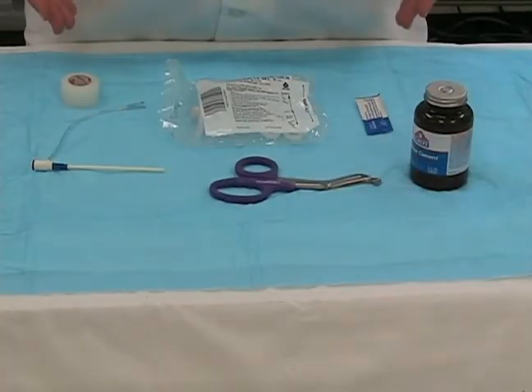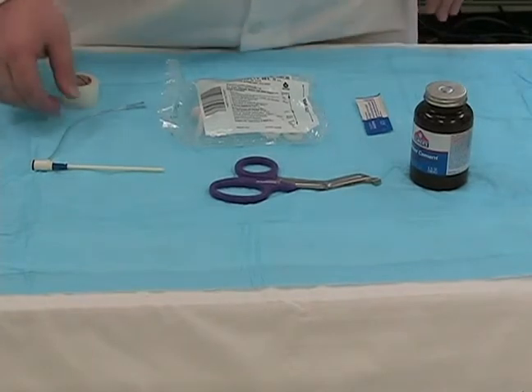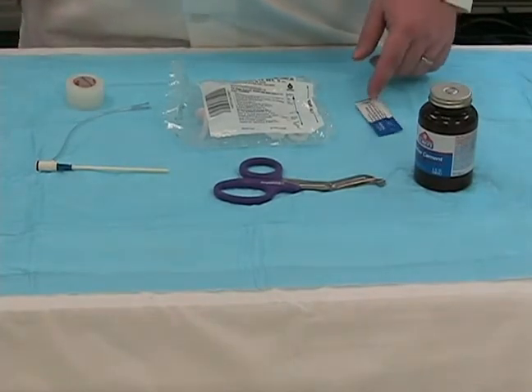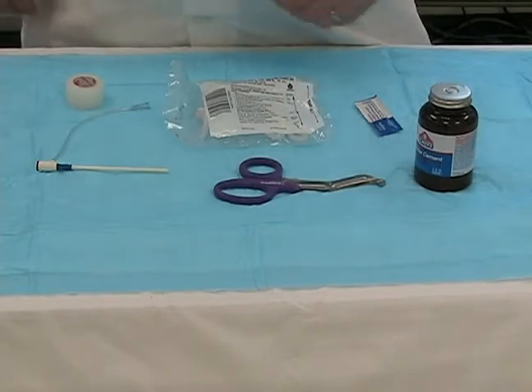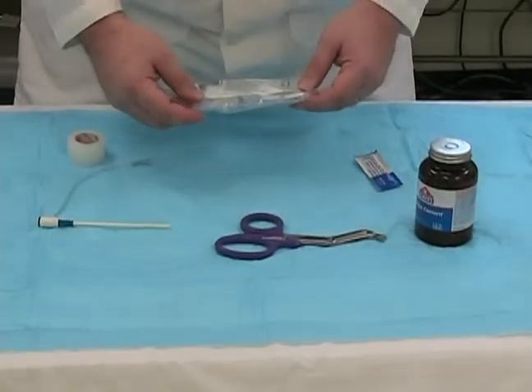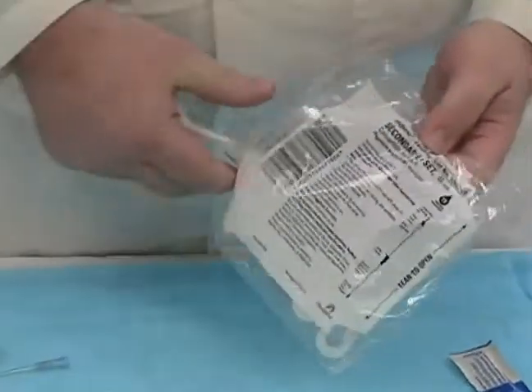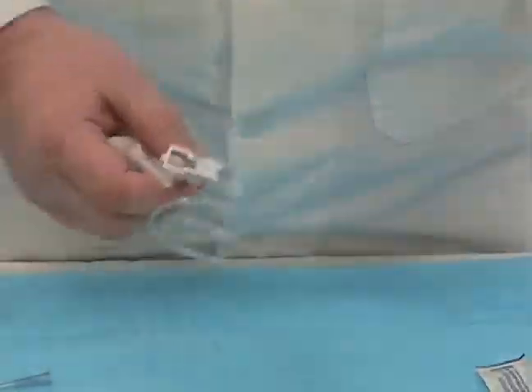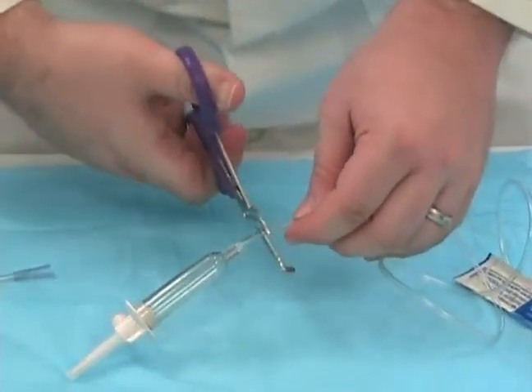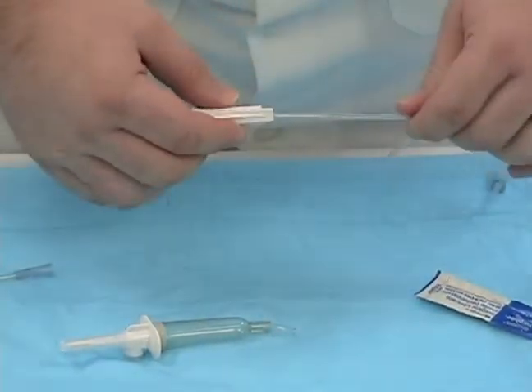Now we're going to show you what you need to create your own cordis line adapter. Start with a number 4 cordis, some Transpore tape, a secondary IV set, Surgilube, rubber cement, and some shears. Open the secondary set, and we're going to adapt it for our needs. Cut the IV tubing just below the drip chamber. Remove the roller wheel. These can be discarded.